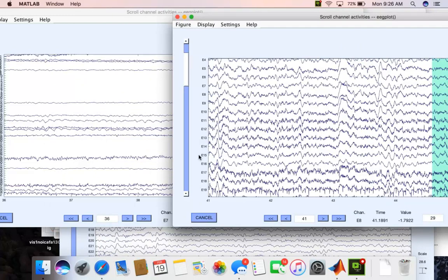So I just wanted to step you through this data. I'm going to make this available as an Excel file, and if I can do it, I'll try to get it also as a .mat file so that you then have the ability to go in and manipulate the data. And what we'll do as our first sort of mini project is look at some of what happens when you look at relevant frequency bands through using some bandpass filtering in an EEG signal.